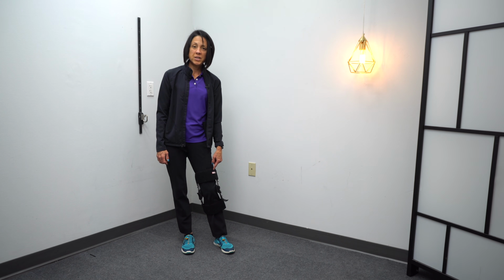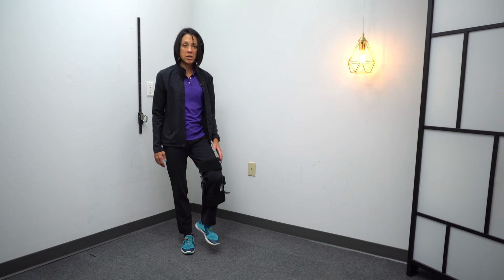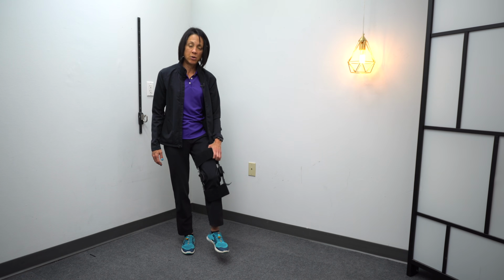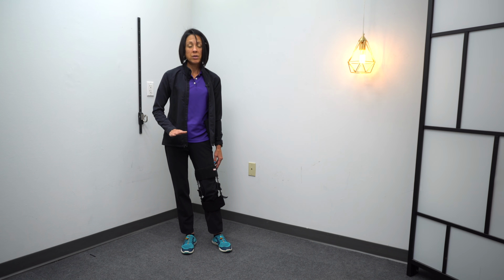And then the other reason that I don't think it's ideal, like I do think the AFO is better, is when you bend your knee, it slides up and down. They do make one that's hinged, but I just don't feel like it works as well, and it's a little bit more bulky. So you're constantly adjusting it. So it's not the best, but I would say as a training tool, if you're someone that has spasticity and you really are having difficulty keeping that knee unlocked because your foot is pointing, I do think it is a valuable tool.